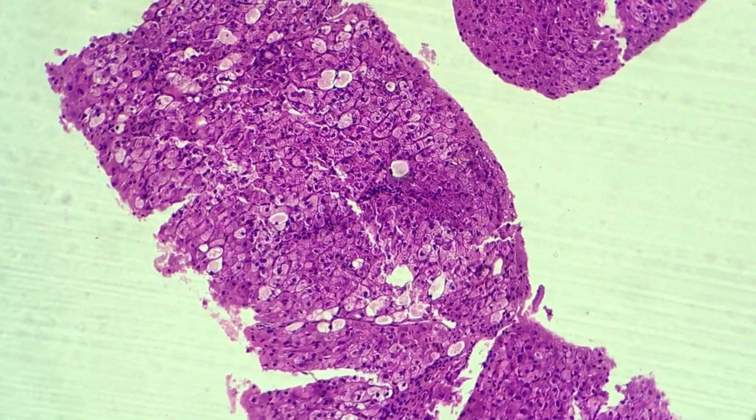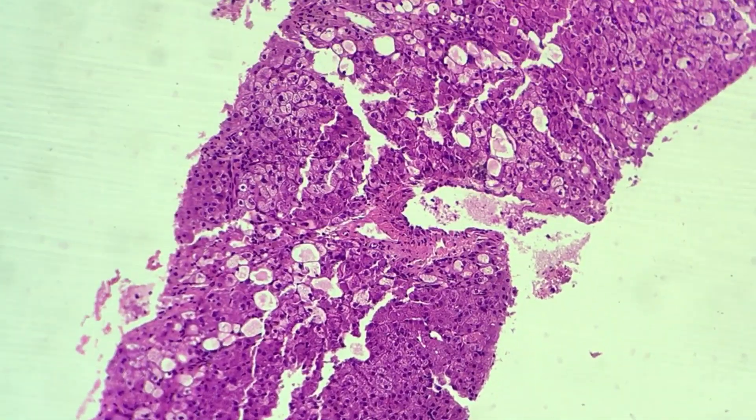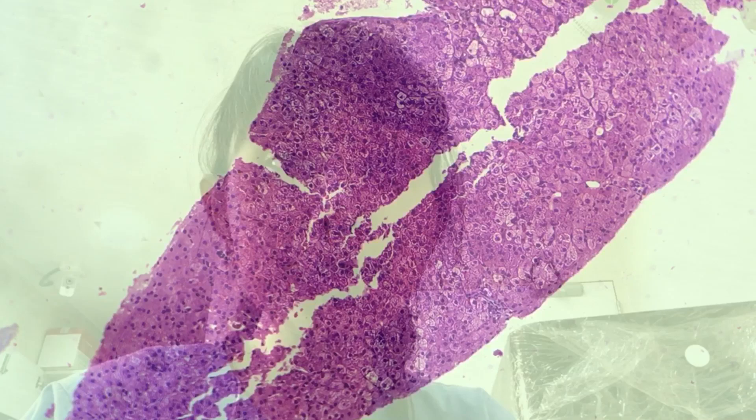Luckily, the report did not show any signs of chronic tissue injury or cirrhosis, which is good news because his condition can be treated. I hope this video was informative — I wanted to walk you through the protocols we follow during ultrasound guided liver biopsy and what happens to your pet before, during, and after the procedure.